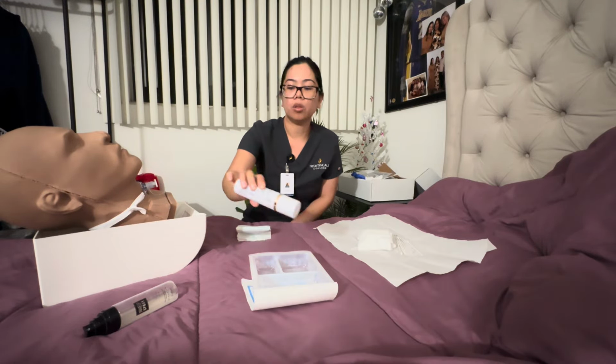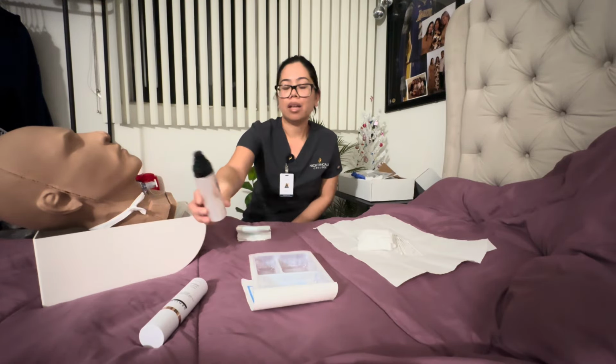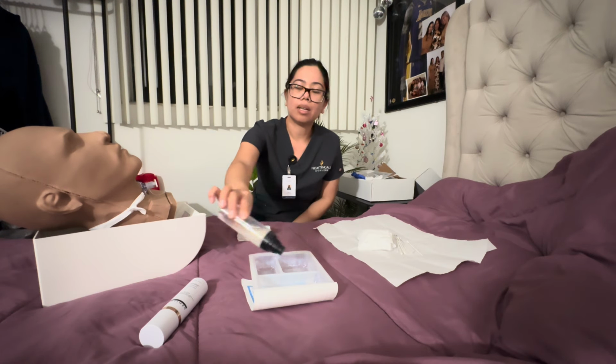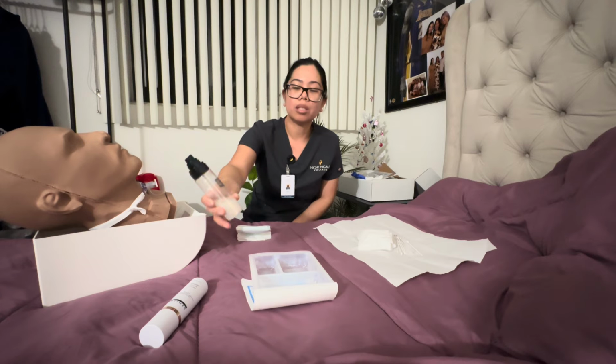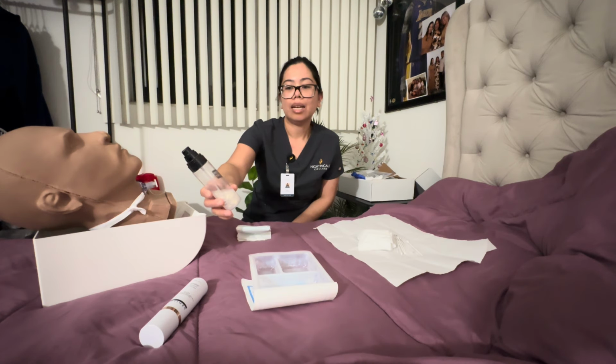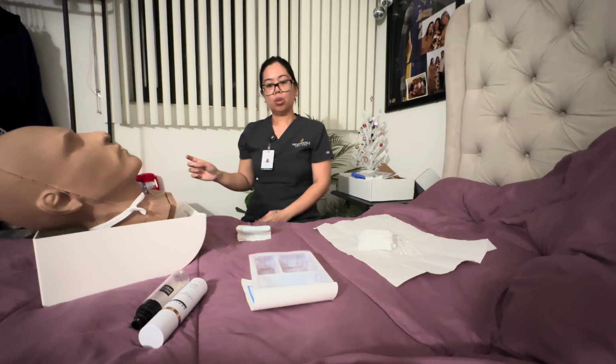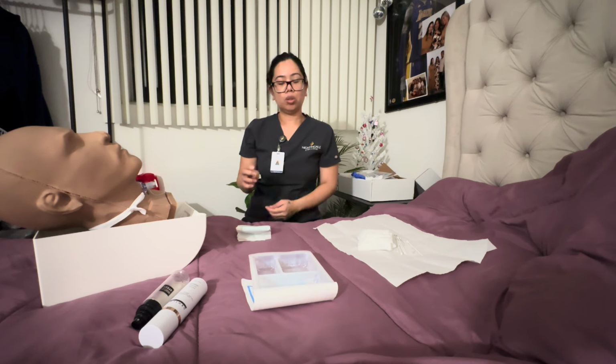We put the normal saline, and for one of them, the soaking solution that I'm going to put in the back, is normal saline and hydrogen peroxide. That's going to be a 1-to-1 solution for our soaking solution. Now I'm going to put on my sterile gloves.